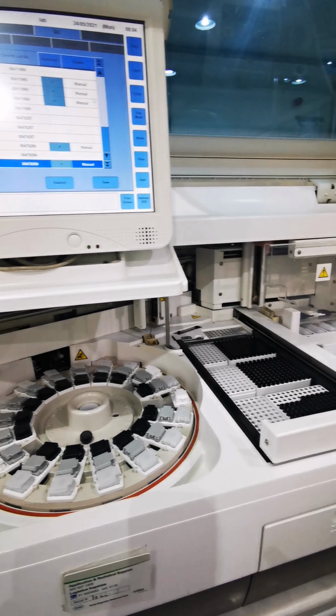Under QC, we will see status on the left side of our monitor. Click status. Now we will see a lot of tests. So we can see the control HIV3, PCU1, PCU2, PCV1, and PCV2 if we go downwards. Now, we can only select tests from PCU2 and PCV2 because those are the controls that we assigned a while ago.